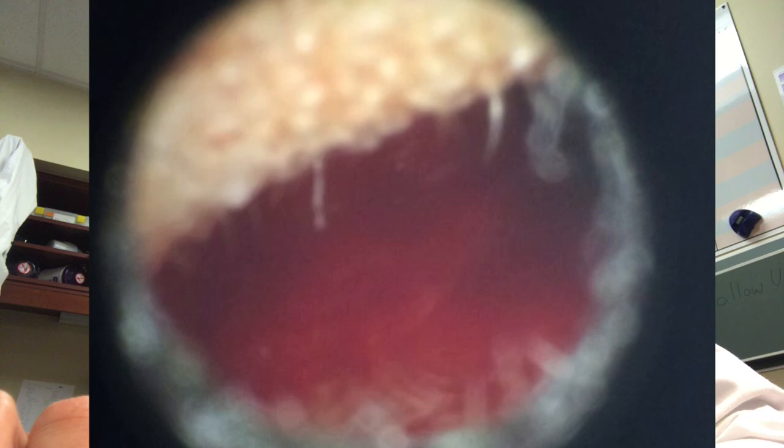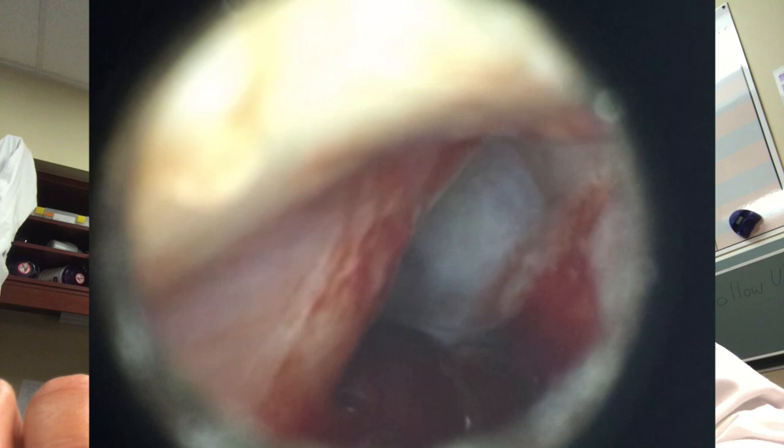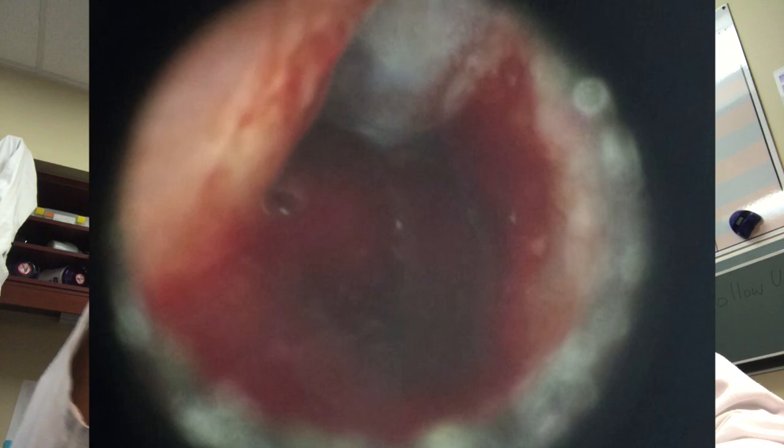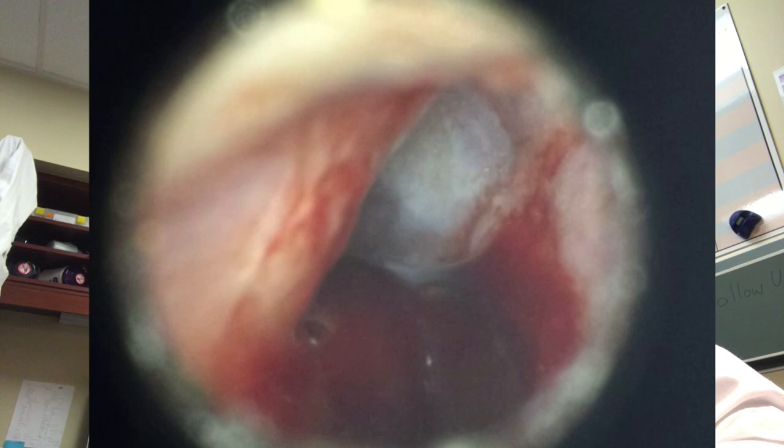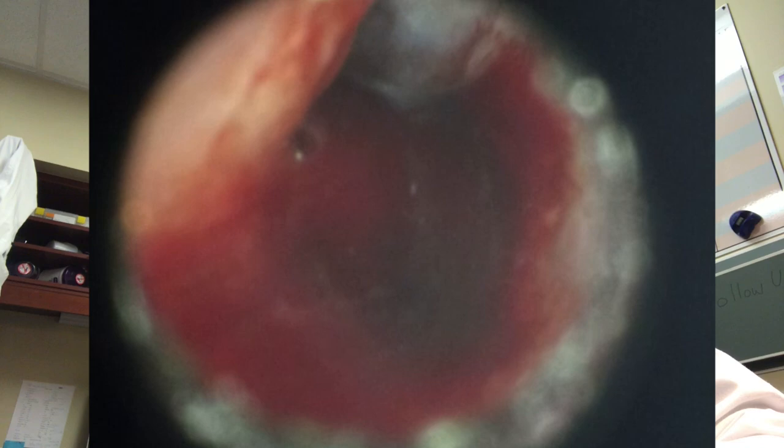The next patient had ear pain followed by bleeding coming out of the ear, so we expect to see a tympanic membrane perforation. As we go into the exam you can see blood in the canal, and going in further you can see the tympanic membrane but can't see all the way through — there's a big clot of blood at the bottom. A tympanic membrane perforation is a tear usually caused by infection, but it can also be caused by trauma or people digging in the ear.